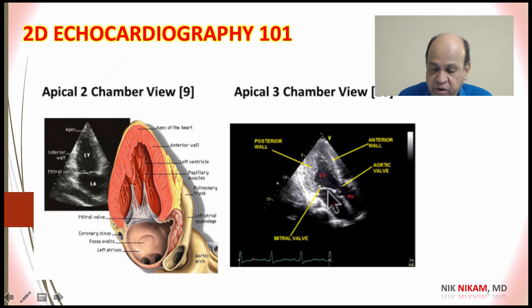Similarly, we can record mitral regurgitation waveforms, and more importantly, we can also get a pulse Doppler of the mitral leaflets, which will enable us to determine the left ventricular diastolic function. And here we put a probe using a pulse Doppler to measure the tissue Doppler, which will also help us to get the diastolic functions of the left ventricle.